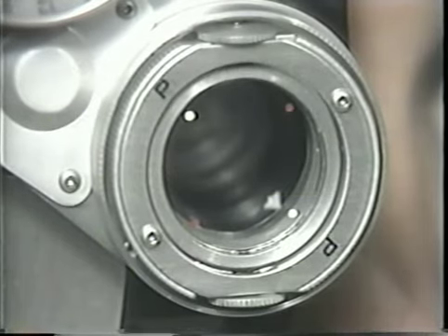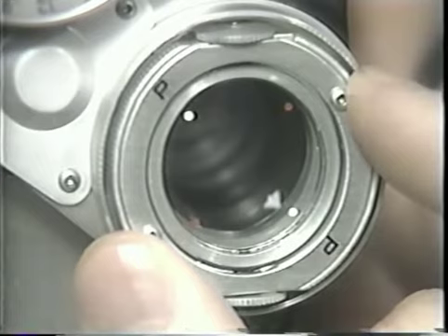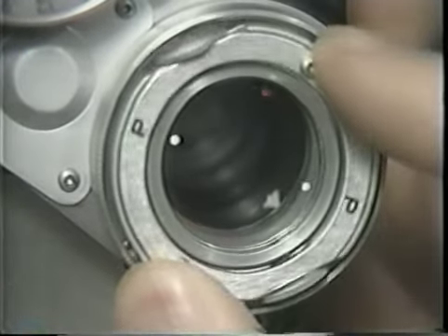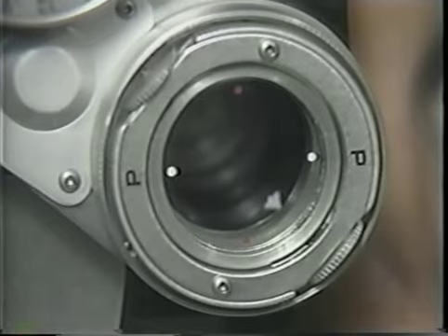incorrect cylinder power, but the correct cylinder power cannot be found if the axis is wrong. Cylinder axis is refined by rotating the cross cylinder until its axes straddle the correcting cylinder axis. On this Reichert phoropter, the cross cylinder loop is synchronized with the cylinder axis, and the cross cylinder clicks into place exactly in the straddling position.